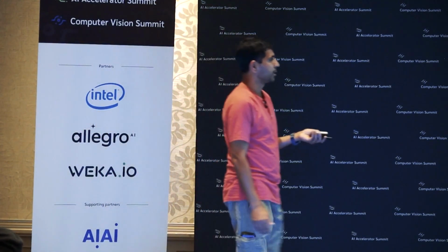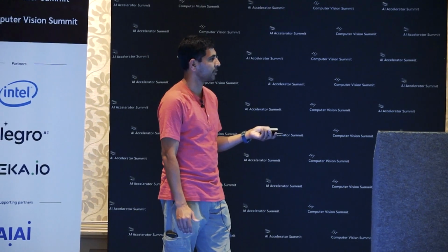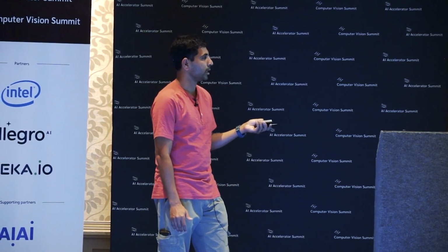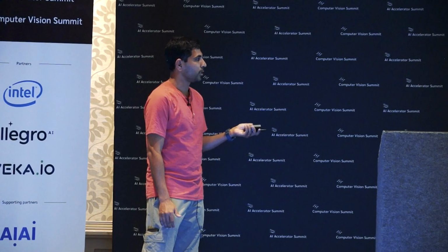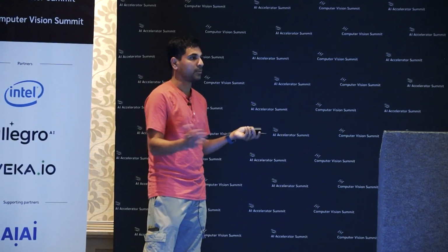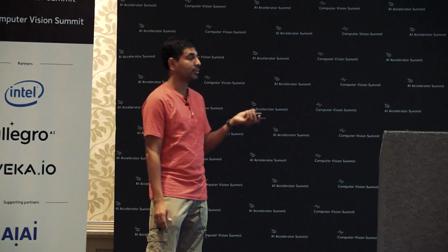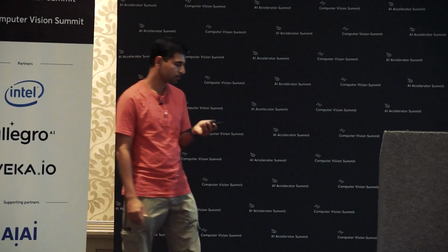So they were essentially looking at 30 seconds' worth of video, and then using a sliding window to determine what exactly was the step in the procedure that was happening. And this here is the confusion matrix that tells you, given the ground truth, the 7 steps, and given the prediction, how the model is doing. You can see that more often than not, the machine is only confused by the step preceding or following it. So there's not too much deviation, and it does pretty well, at least on this particular data set.